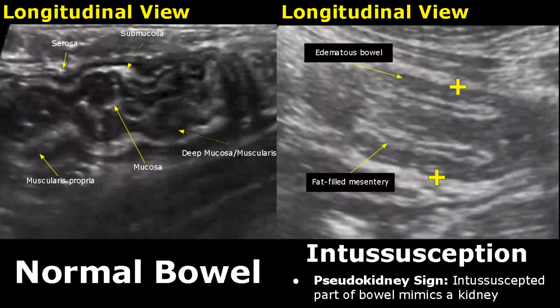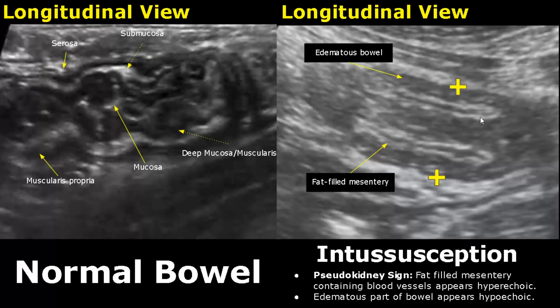A pseudokidney sign is another feature of intussusception. You will see that the intussusceptive part of the bowel will look like a kidney in the longitudinal view. The hyperechoic areas are fat-filled mesentery, and the outer hypoechoic layer is the edematous part of the bowel.